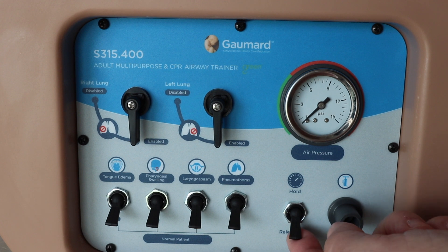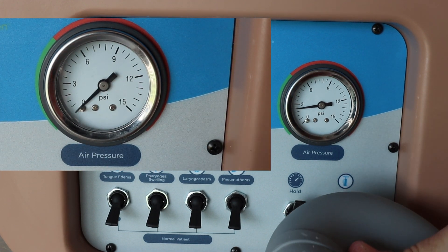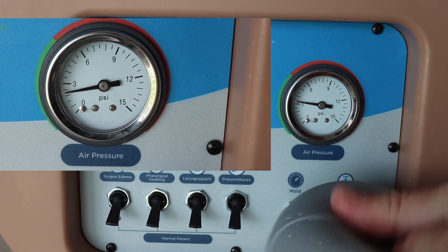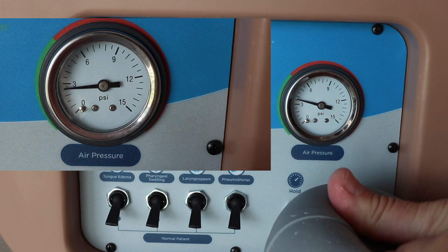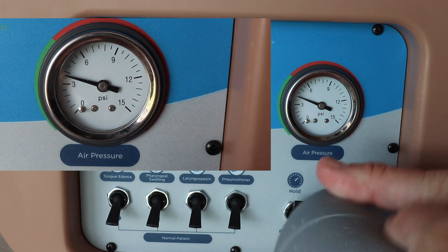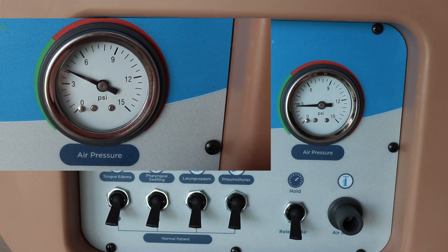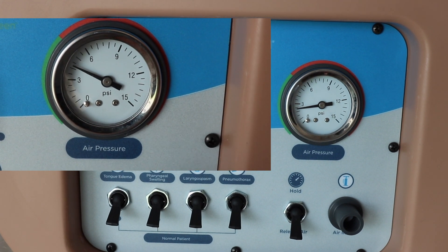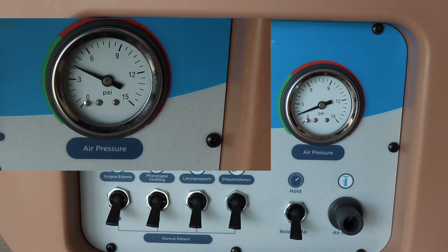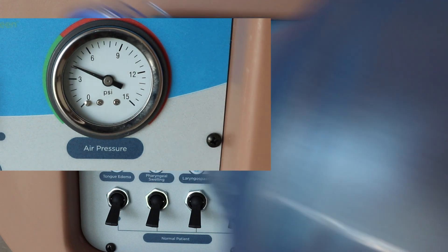We want to stay in the green, and you also have to flip up the knob that says hold. If you don't flip up that hold knob, it's not going to hold any air. Be careful — you don't want to over-inflate the system, as that will damage it and result in the mannequin not working appropriately. Once you're done with the system, just flip the switch down to release and your air will drain right back out.